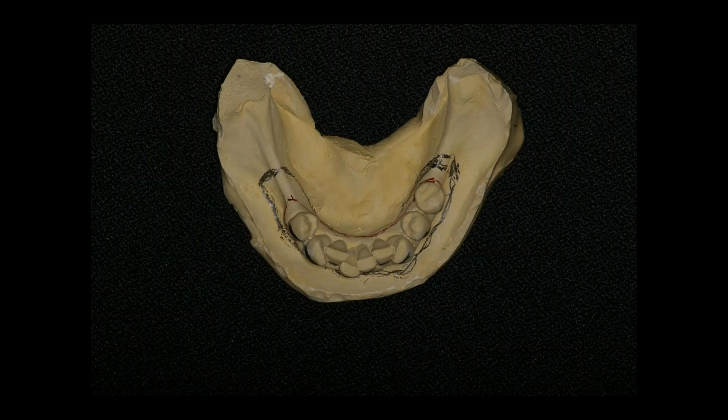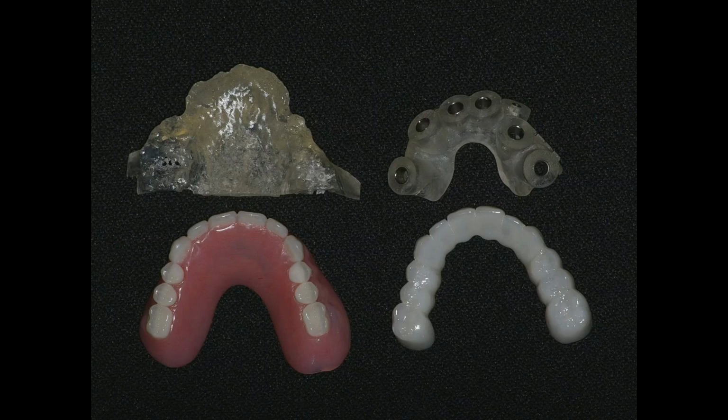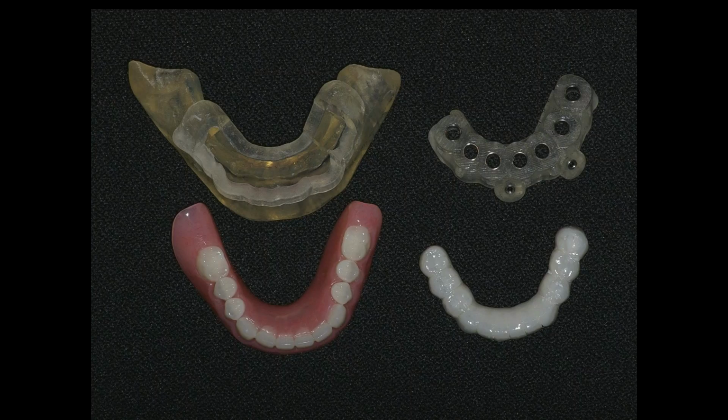And so what we have is not only this bone level surgical guide, we have an immediate denture and also immediate fixed restoration in case we do get enough torque and a good reading on the Osstell unit to be able to provide fixed. And we have that also for the top as well as the bottom. And on the bottom, we're also going to be doing quite a bit of leveling, as you can see here. This is a bone leveling guide, the surgical guide, the immediate denture, and the immediate fixed temporary.